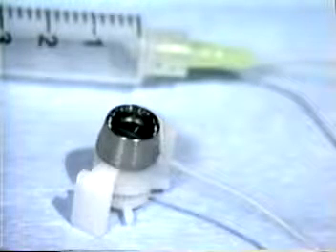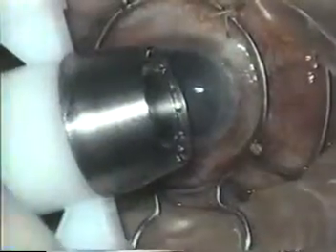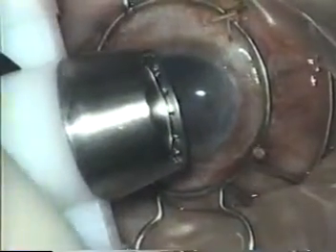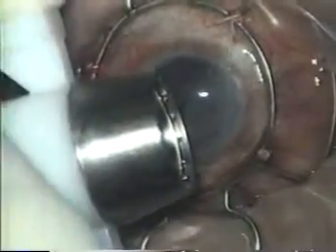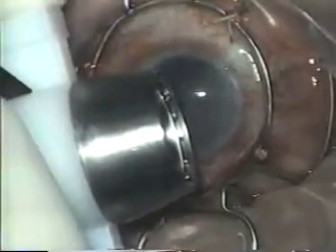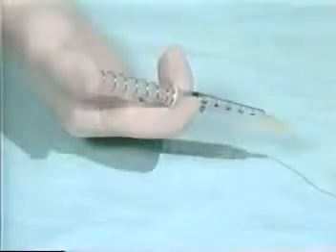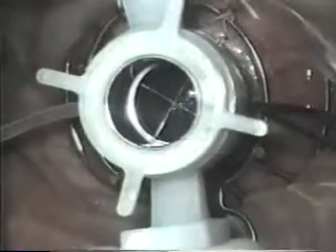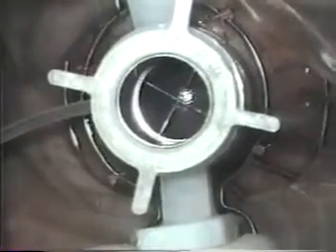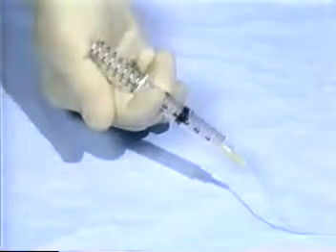Cutting and marking the recipient cornea with the trephine requires only a few simple steps. Before the surgeon places the trephine on the cornea, the edge of the blade is aligned with the bottom of the inner wall of the vacuum chamber. This position on the blade is called the zero position. The blade is then retracted three spokes and the plunger of the syringe is pushed in all the way. The crosshairs of the trephine are then aligned with a centration mark that has been made on the cornea. The trephine is pressed evenly on the corneal surface and the plunger is released abruptly to create a vacuum.